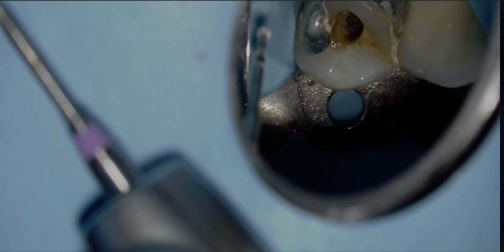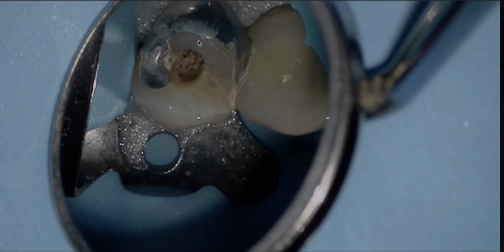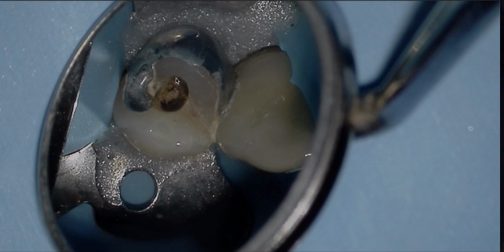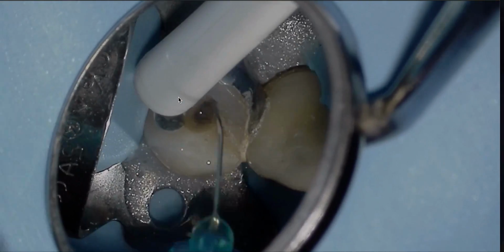But unfortunately, I wasn't happy with this. It opened up a little too much mesially. Is it the end of the world? Definitely not. So what that burr does is it goes into that little spot that I opened up right here, and I'll go back and forth and open that chamber up. But I wasn't happy with it, so I elected to go back to that slow round burr and open up. You can see how it opened up a little bit too much more, the mesial. I mean, look at the bigger picture. It's not that big, but we're trying to do our best. So we're going to irrigate all that debris out.